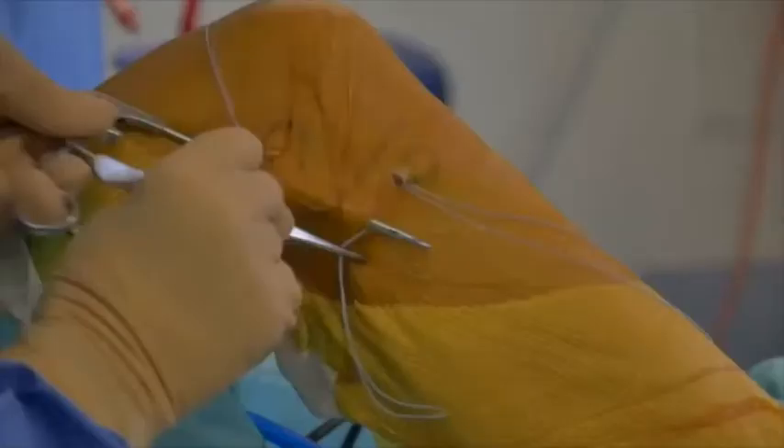The ALL graft is then shuttled deep to the iliotibial band. It is then passed through the tibial tunnel using the previously passed sutures and then shuttled back proximally deep to the IT band.